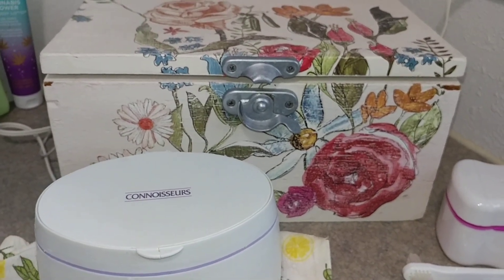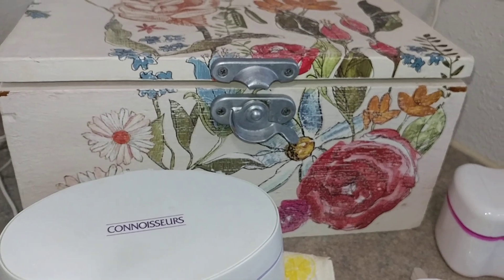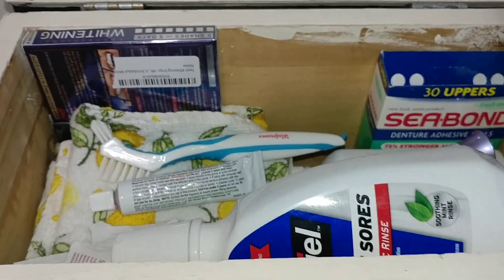I bought this box that sits on my bathroom counter and it's got all my denture supplies in it. So I'm going to go ahead and pop this guy open and show you what we're looking at.